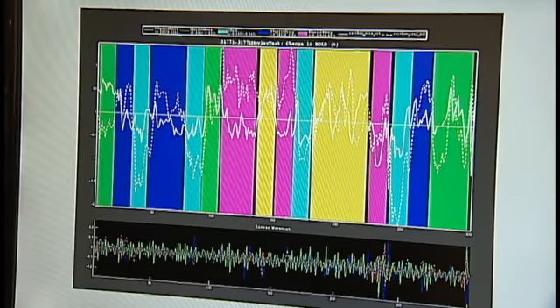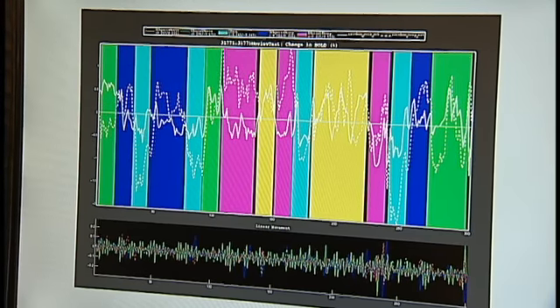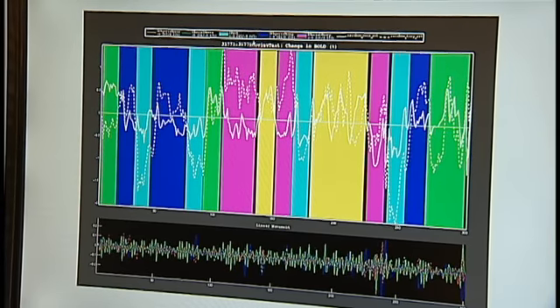For instance, here you can see an in-house program that we call a rainbow plot, which is a plot that shows the raw time course of BOLD, or blood oxygen level dependent signal from a region, with the different task conditions shown by different colors in the background. Here, the dotted time course is taken from a visual region in the brain, and we can see that the activity is lower during the rest periods, which are light blue.